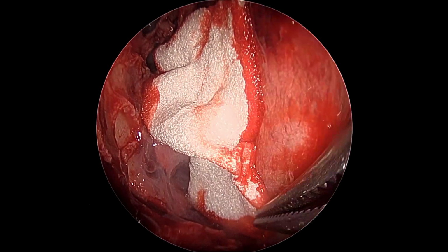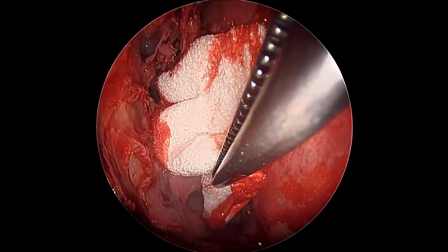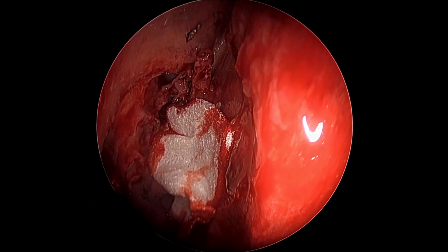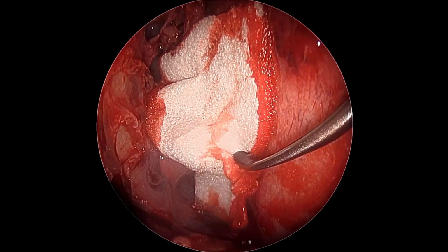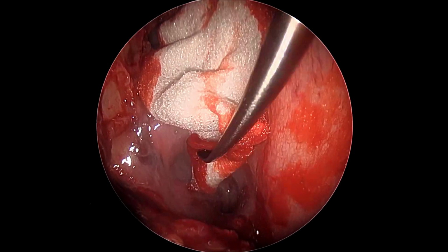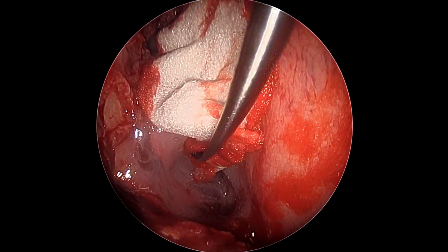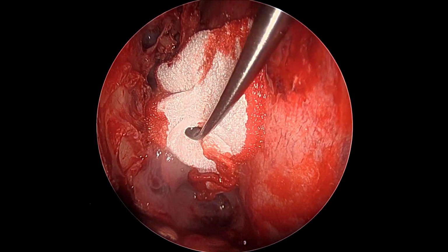And in the end, we just use a large, thin, compressed gel foam sheet to cover this assembly of ours. Gel foam absorbs a lot of water into it, much more than its volume, and can help secure this graft very well. We once again use the same instrument to gently appose the gel foam onto the graft. We prefer to avoid covering the sphenoid os with this gel foam.